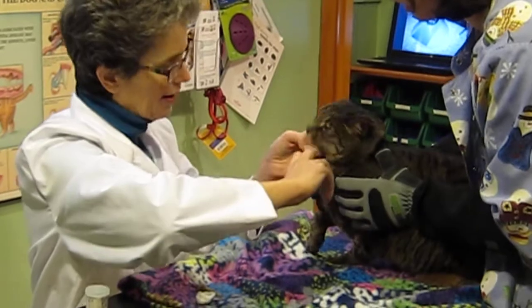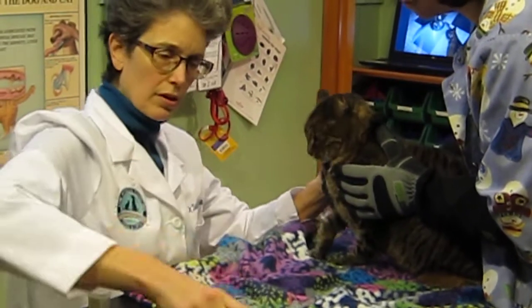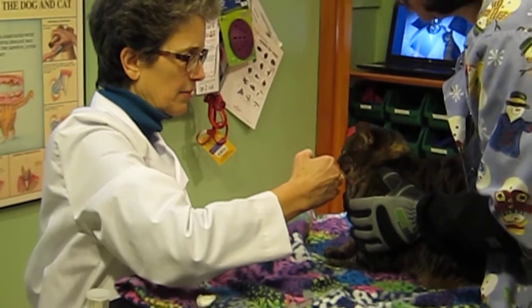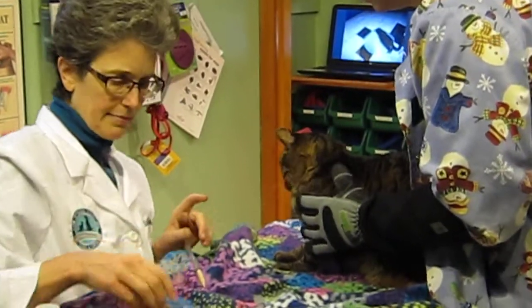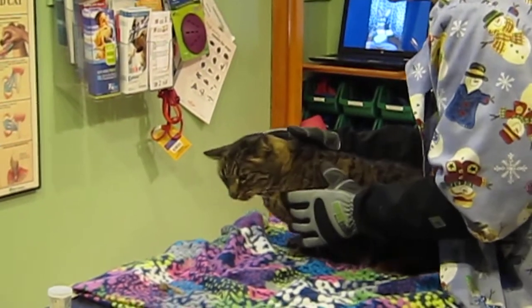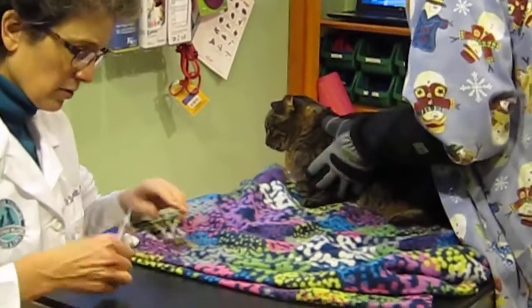Put your neck up. He's embarrassed — it's shaved. You're going to get a little good thing. You're not eating lidocaine because that would make you feel numb. We're not going to struggle with him because struggling will escalate the cat and they'll be more likely to bite. So let's come back around here and see if we can try this again.